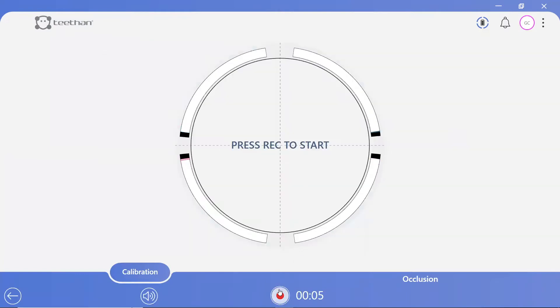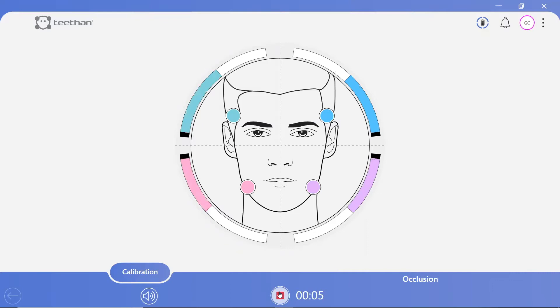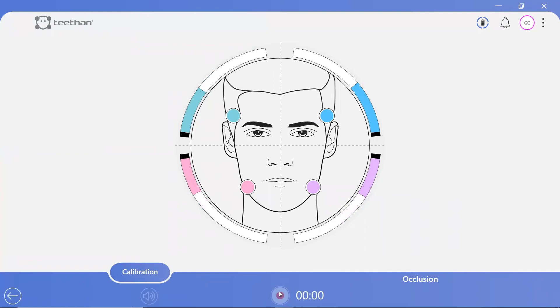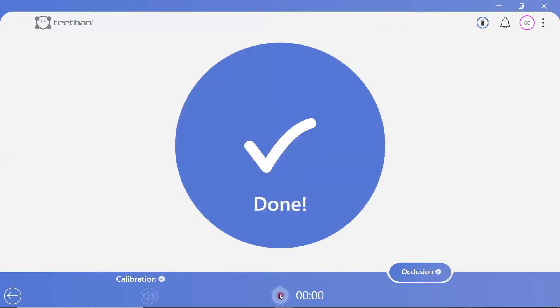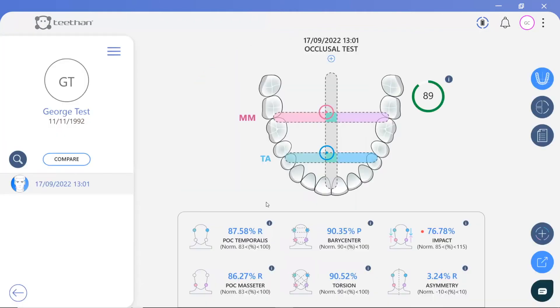A new test begins with a 5-second calibration. Two cotton rolls are placed between the dental arches of the 5th and 6th teeth — the 2nd premolar and the 1st molar — and the patient is required to perform a maximal clench throughout the 5-second period. The cotton rolls are then removed and the patient performs another maximal clench for 5 seconds, and instantly the patient report is generated.